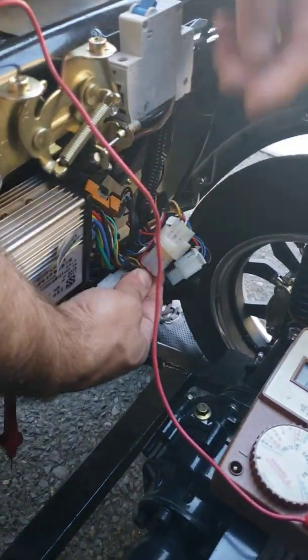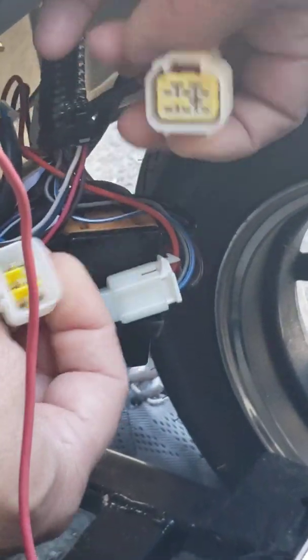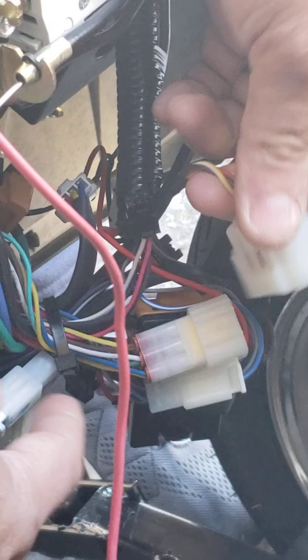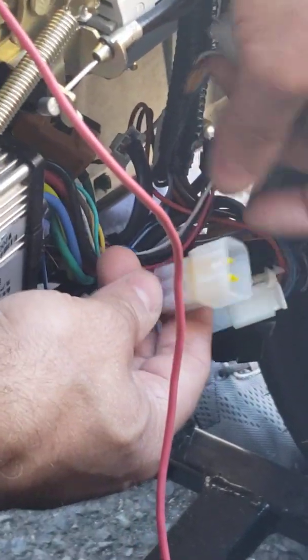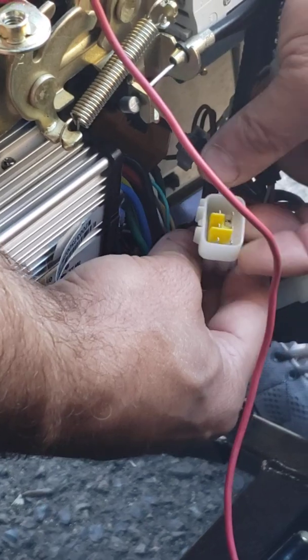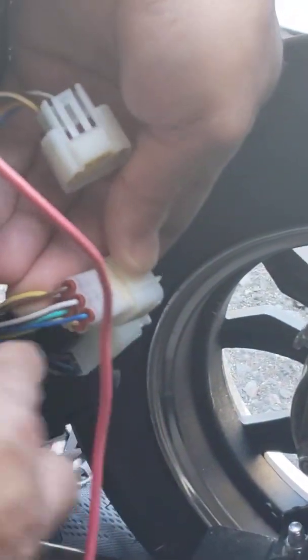Once you set the multimeter to ohms, look for the biggest plug among all of them — the one with six pins — and unplug it. The female side comes from the scooter itself and the male side goes into the main controller. Look for the two corner wires, which are the brown and white wires.